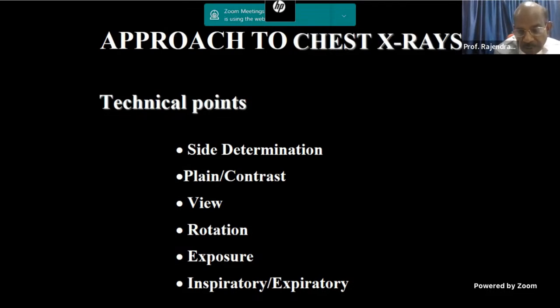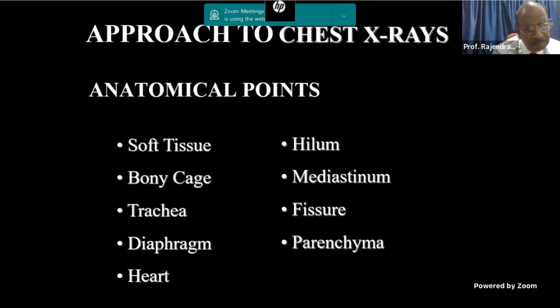Exposure also is very important, whether the film has been done in full inspiration. This is one of the very common mistakes, that the film is not done properly. Ideally, a chest X-ray PA view should be done in full inspiration. Sometimes it is not done, and it creates a lot of problems. So those things you have to understand.